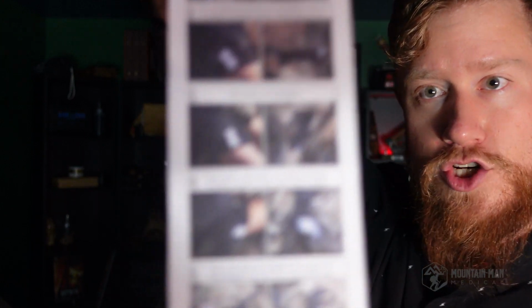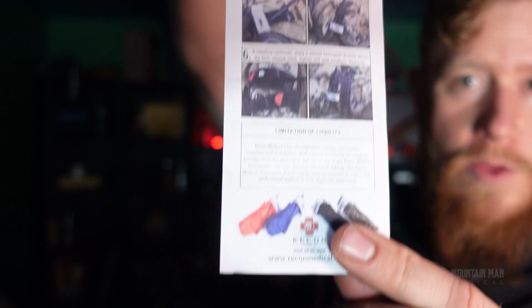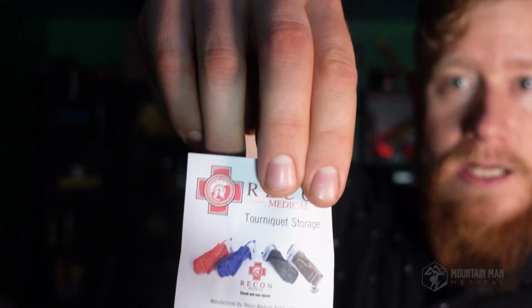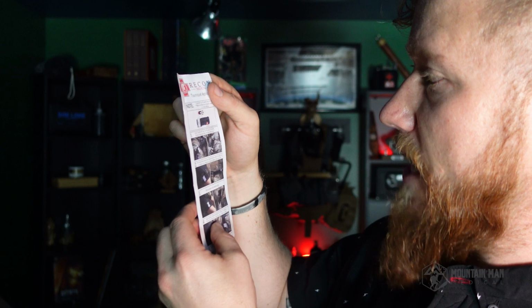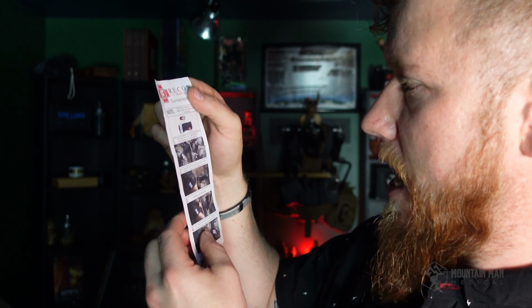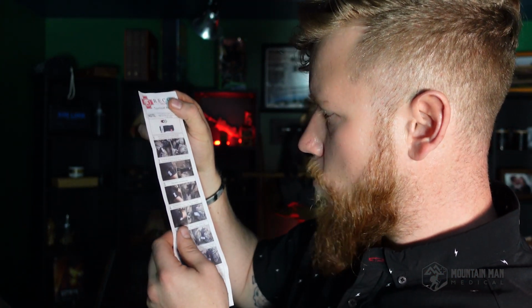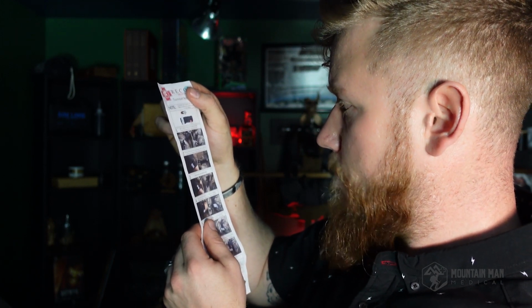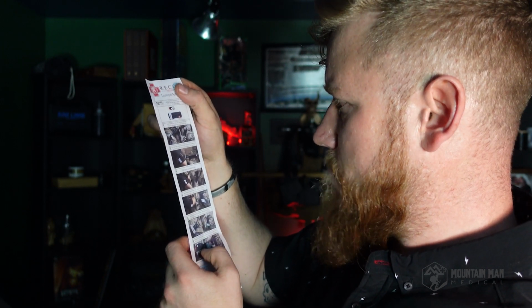These are the instructions, and we've got some pictures here of how the tourniquet works, and then on the back there's more. So let's see what this has to say. Step 1, insert injured arm or leg into the loop in the band. Position tourniquet high into the armpit or groin, or 2 to 4 inches above the wound. Pull the band tight around the arm or leg, and secure Velcro up to the windlass clip. Okay. Remove all space between band and skin. So pull out the slack.